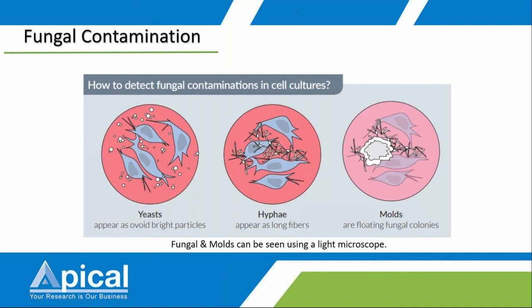If it's very highly contaminated with fungus, you'll start seeing hyphae, so literally you can see them with your naked eye. When it comes to mold, you will have floating colonies forming on the surface. When you have mold or hyphae or yeast, we wouldn't know which is producing a dormant spore. So you wouldn't want to open such a culture dish, and you want to avoid spreading the spore. This is the most important. When you see such, you need to discard that particular sample.